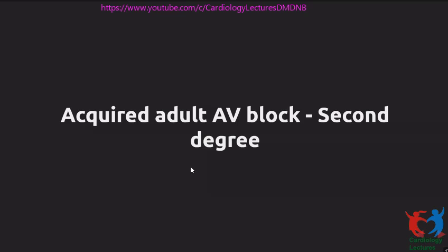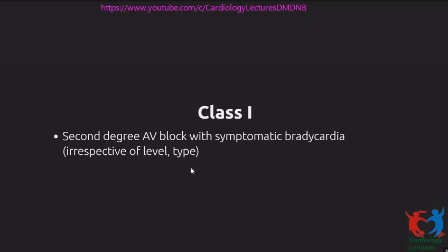Now, what happens with second degree AV block? There are a couple of important things here, which is to try and distinguish type 1 from type 2 AV block. So you know the ECGs, I'll show you some of the ECGs also. Type 1 AV block is the classic Wenckebach rhythm, where you can see that consecutively conducted beats have a progressive prolongation of the PR interval, followed by block of one P wave, and then conduction resumes from the next beat onwards. Whereas a second degree type 2 typically has no change in the PR interval among the conducted beats. That's one of the things.